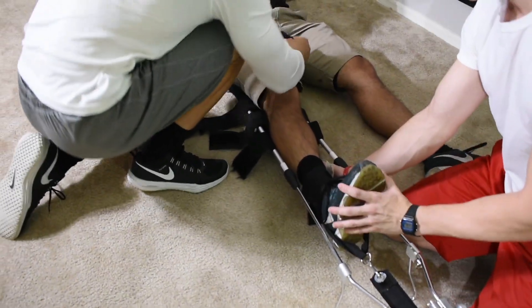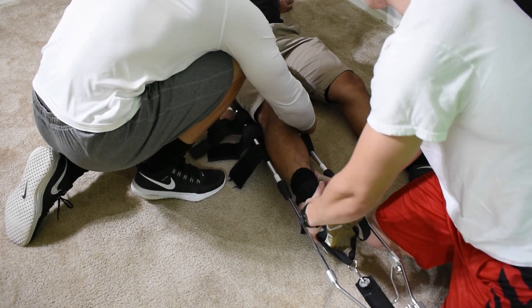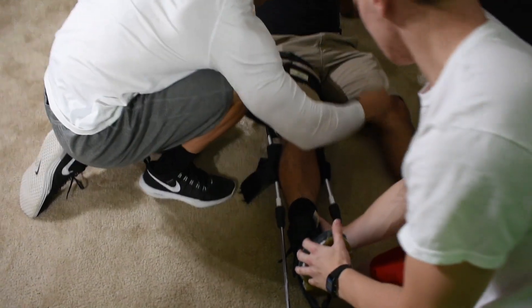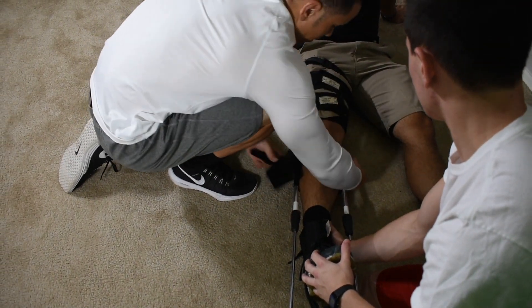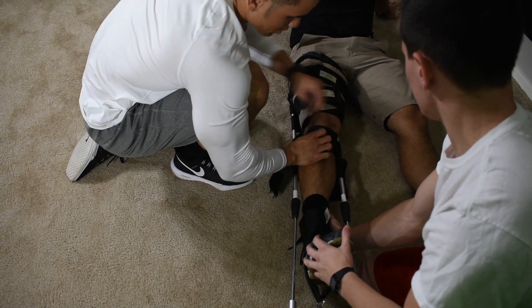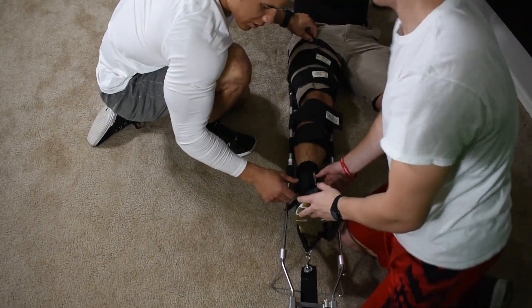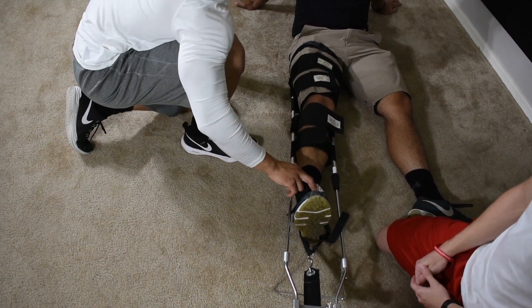Now I'm going to secure two straps above and below the knee and secure the traction splint to the patient. I'm going to reevaluate, make sure they're on — and reassess for CMS, present.